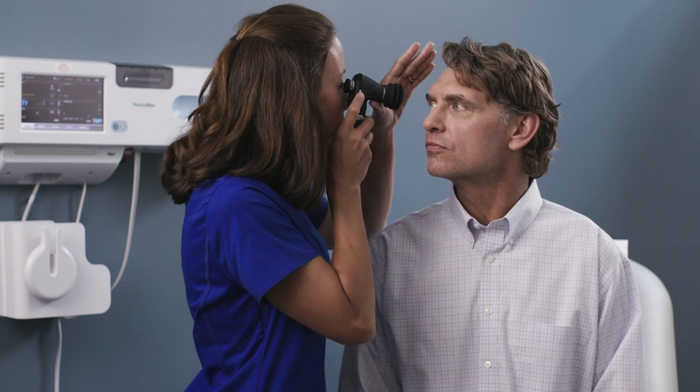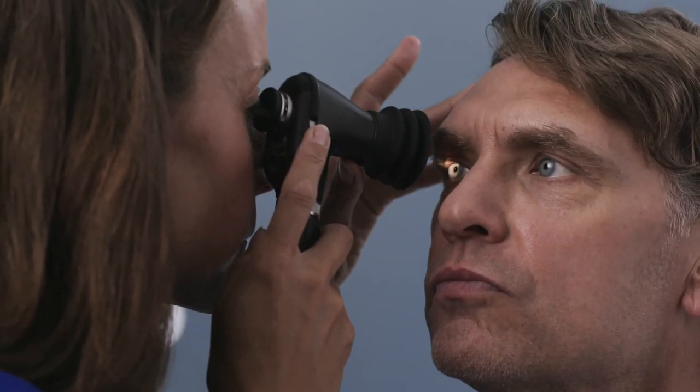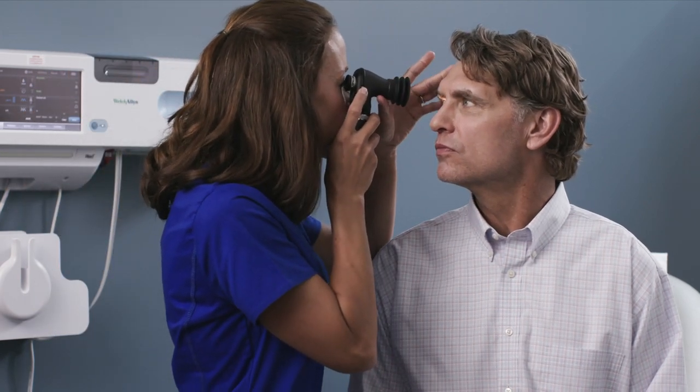The correct working distance is important with any ophthalmoscope. Devices like the Panoptic let you stay further from the patient. You'll get better with practice, but you'll know you have the right distance when you get a good view. If using the optional eye cup, explain to your patient that it will only touch their brow, not their eye.